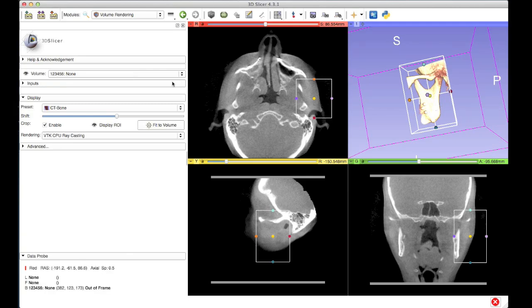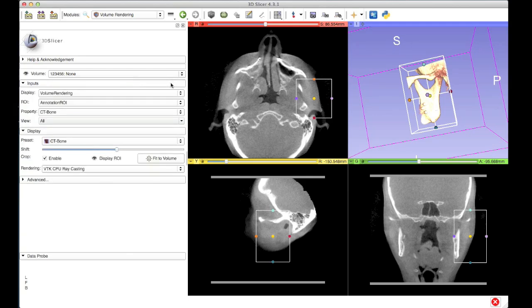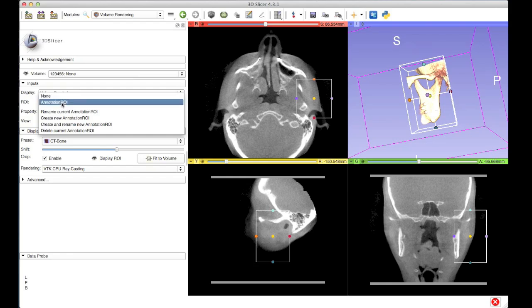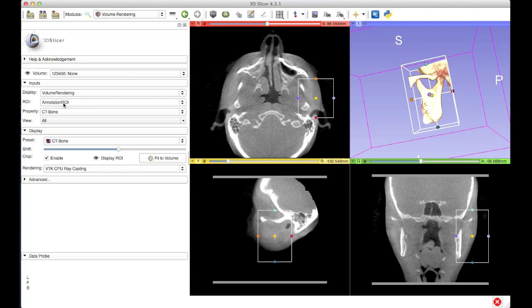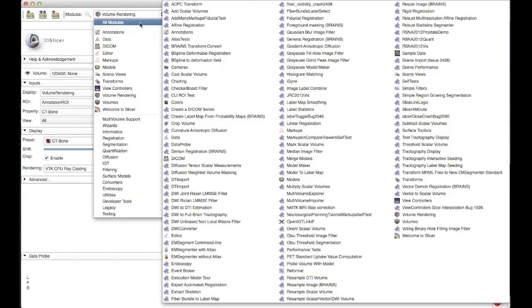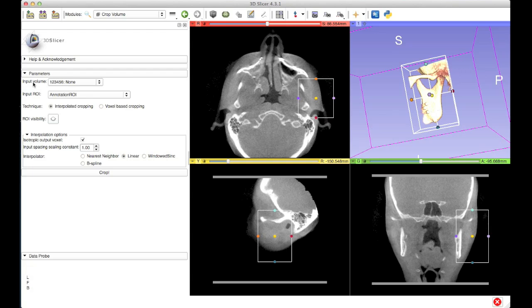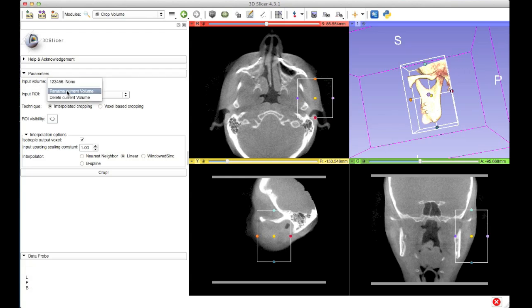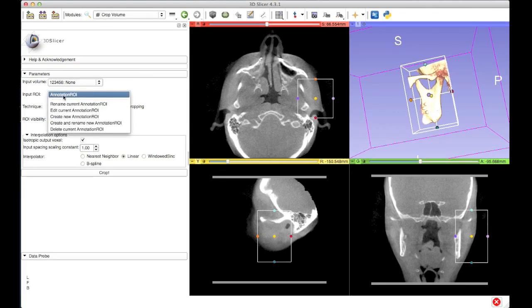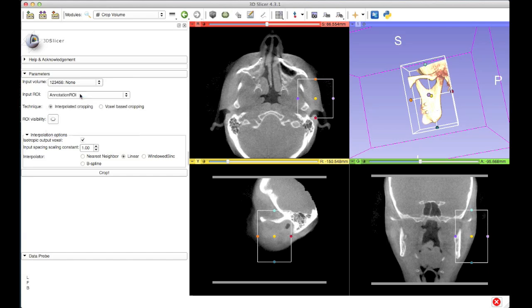Now I'm fairly happy with the ROI that I've created — this is the sub volume I want to crop down my cone beam CT to. But I haven't done any cropping yet; all I've done so far is create an ROI that contains the sub volume I'm interested in. So I'm going to reveal the inputs tab of the volume rendering module. In here you can see that the region of interest I've just created is called annotation ROI, and I'll use this name in the crop volume module. I'll load crop volume by revealing the full list of modules and selecting crop volume from among them.